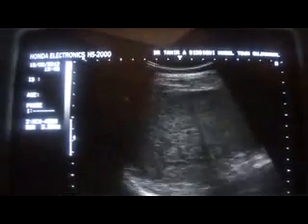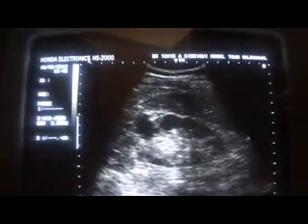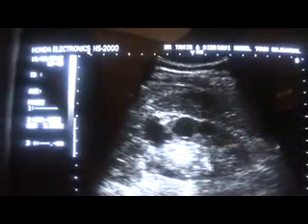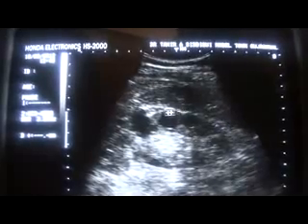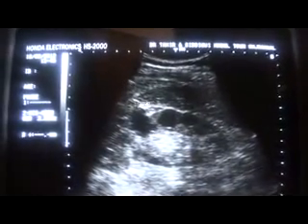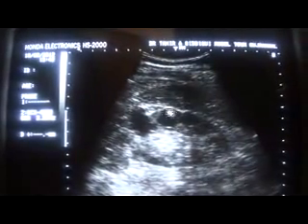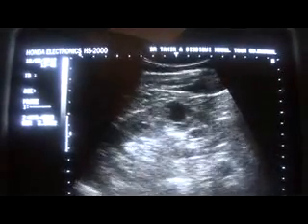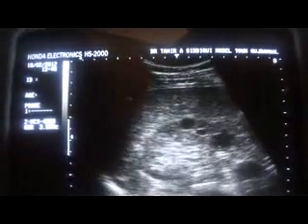and now you will be able to see the cysts. See the cyst in transverse section. This is a cyst, all involving the renal parenchyma with the central sinus echo complex spared. The outer surface of the kidney, the capsule of the kidney, is regular, smooth, and no bulging is seen. So this is a multicystic kidney. Presently we are studying the right kidney.